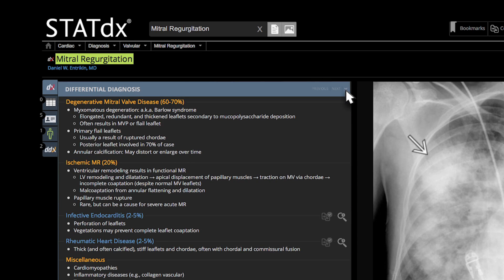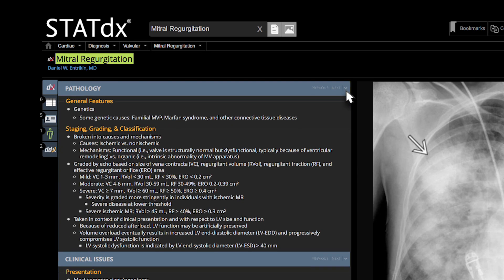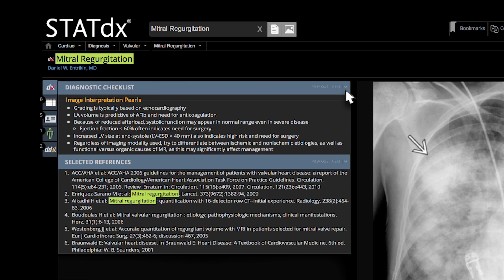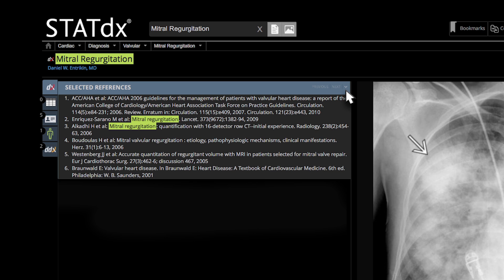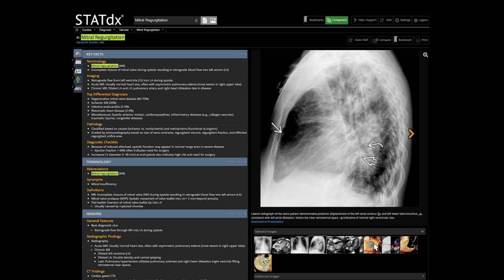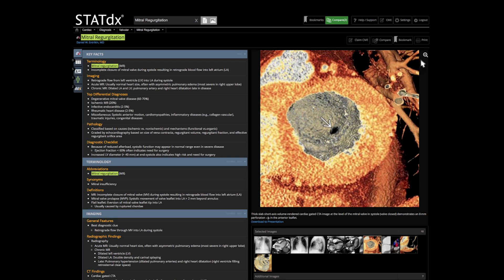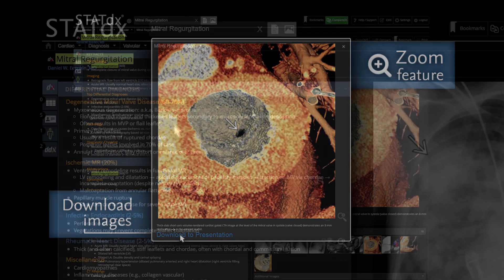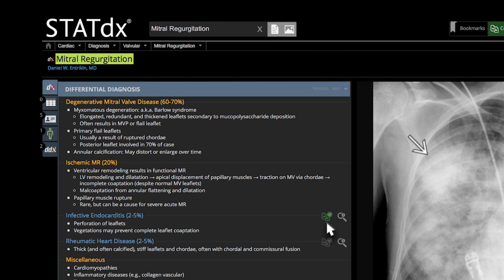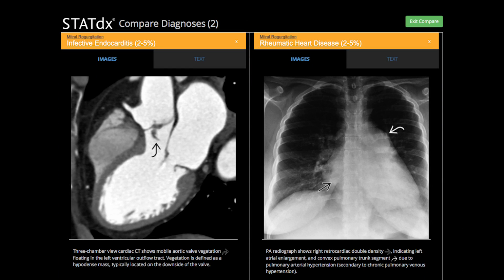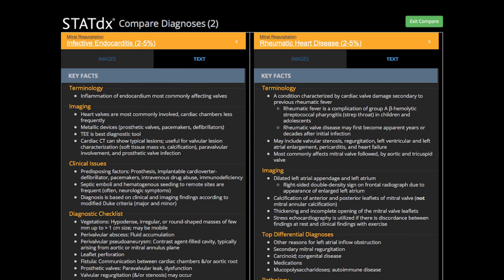Additional sections include differential diagnoses, pathology, clinical issues, diagnostic checklist, and selected references. On the right, the diagnosis is supported by high-quality images. Any image can be increased in size or downloaded for a presentation. Diagnoses of interest can be bookmarked or saved for a later comparison. STAT-DX's compare feature allows for easy and direct comparisons of images and text to help distinguish between diseases.